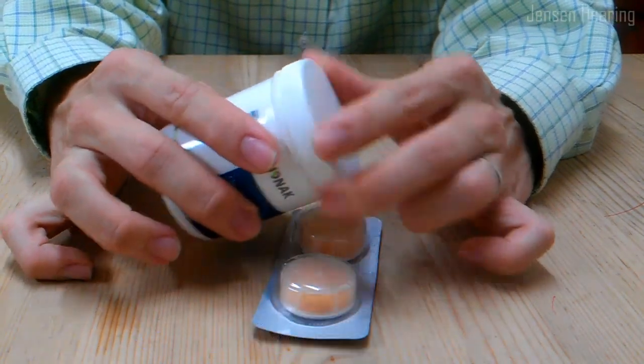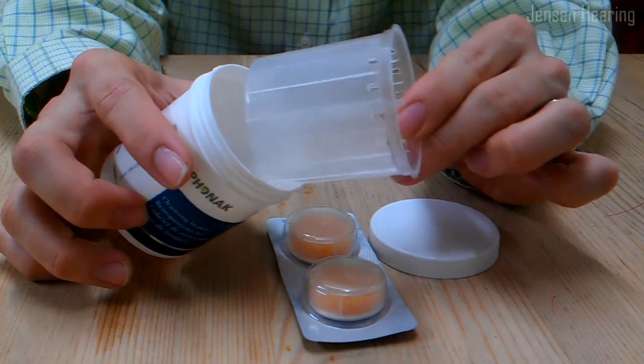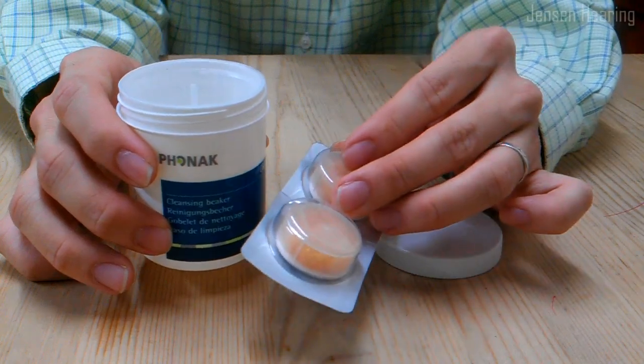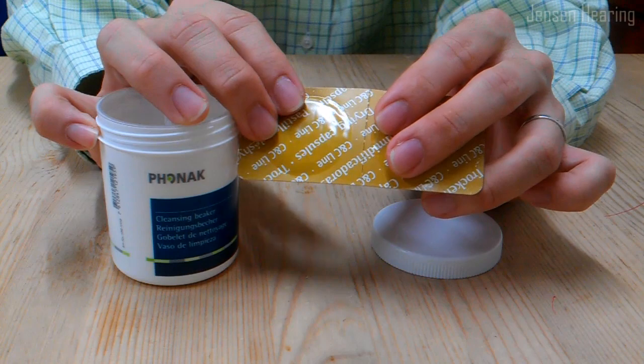If you unscrew the drying beaker, there is a little inner sleeve inside. The purpose of the sleeve is to separate the hearing aid from the drying capsules.